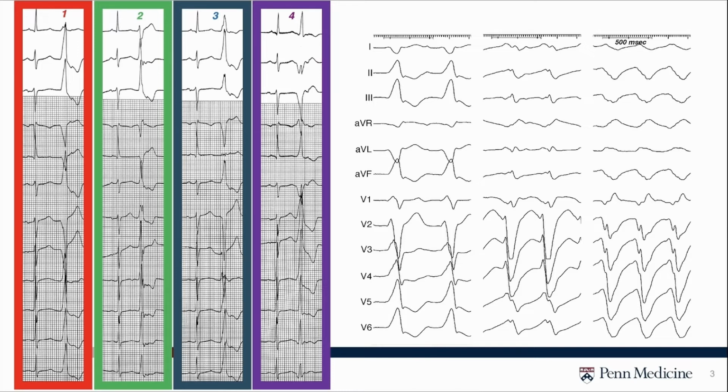But if you think about it, these 3 PVCs all share a common area, which would be the septal aspect of the heart. And then you have a 4th PVC that is completely different in the sense that it's superior axis, but still with septal characteristics, being very positive in 1, and right bundle with no transition, so it would be in the inferior septal portion of the left ventricle.